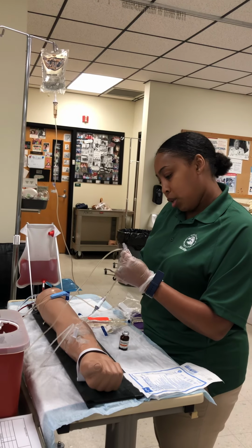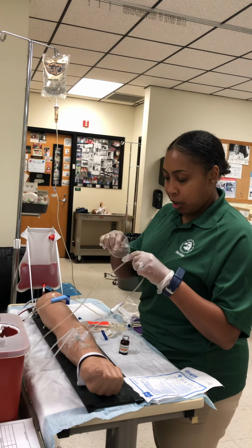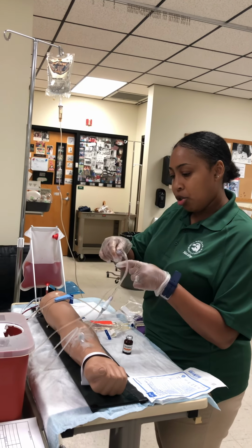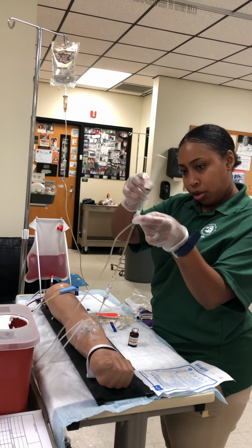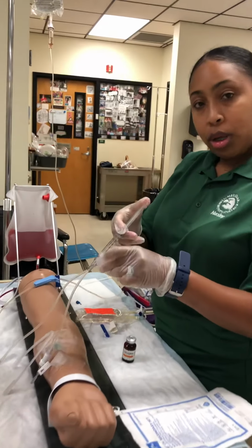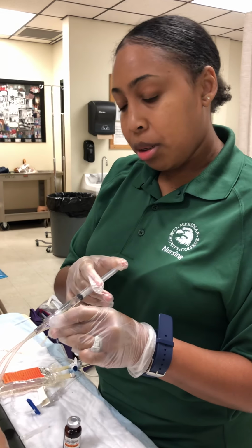I'm going to remove this. And I'm going to attach. We're going to pinch the tubing. The tubing is pinched. We're going to say that we would administer this over 1 to 2 minutes. We're going to verbalize 1 to 2 minutes.